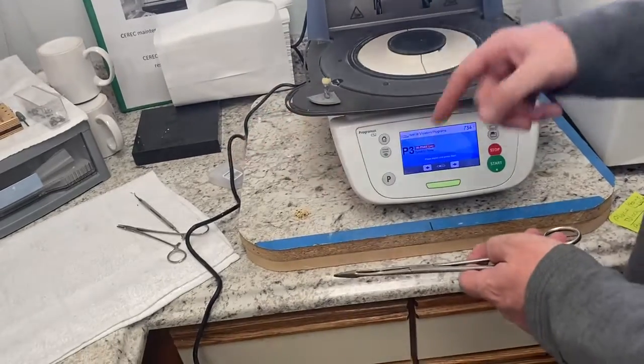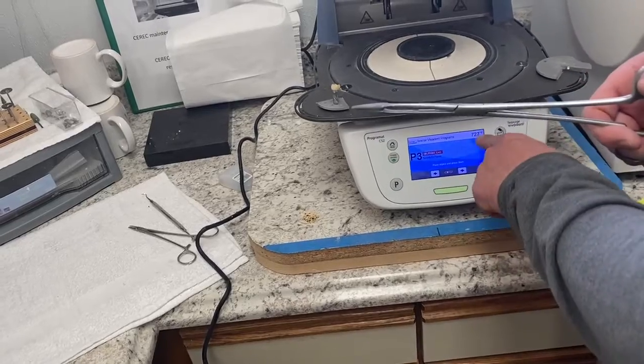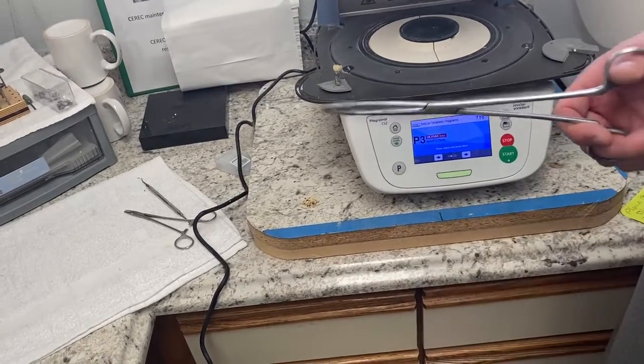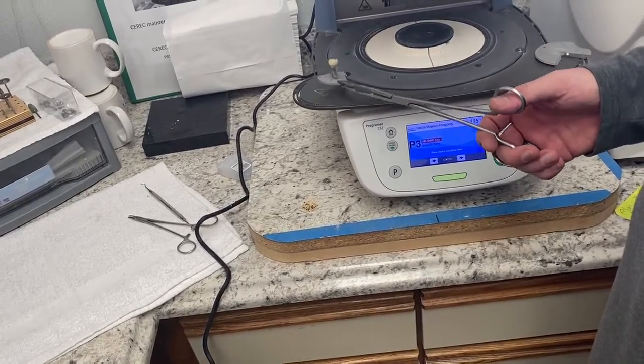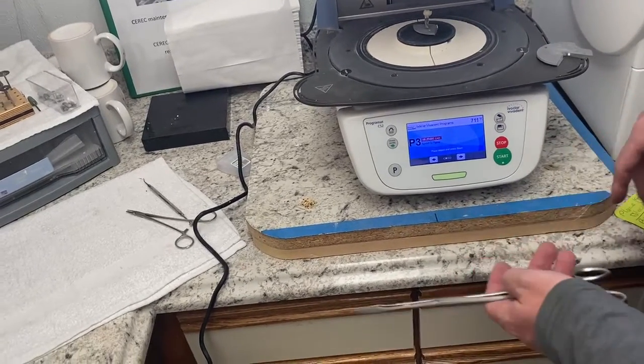If you use the little one or your hand, you're going to stick your hand in there and it's going to burn you. It's 500 degrees in there. Right now it's 750 degrees. 750, so it's really hot. So don't do it. Always use your instruments.